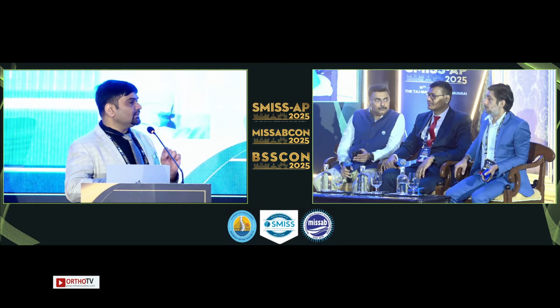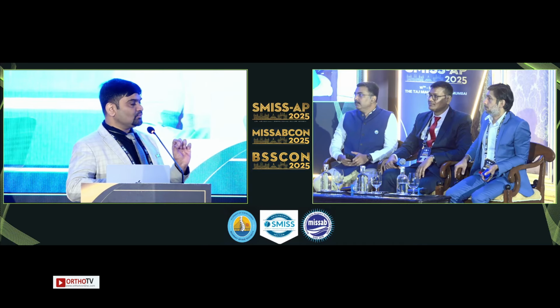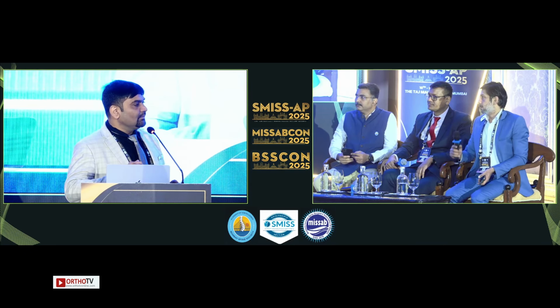I would recommend that if a beginner starts with endoscopy, he should attempt only discectomy. For that matter, he should buy the transforaminal scope. So he can do transforaminal endoscopy and L5-S1 or L4-5 large interlaminar endoscopy. Once he is acquainted, around 50-100 cases, he does the discectomy. If he wants to progress further with stenosis, then he can buy a stenoscope. But initially with the transforaminal scope, you can do both transforaminal and interlaminar endoscopy. If you buy a stenoscope, then your transforaminal option will go, so you can only do interlaminar endoscopy.